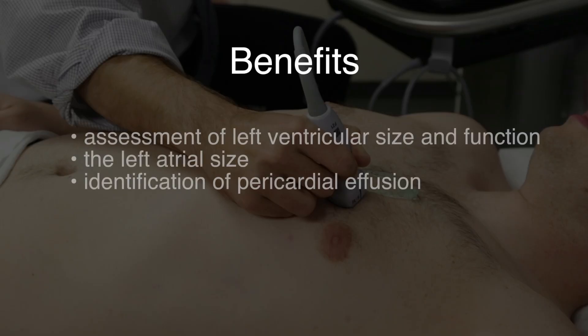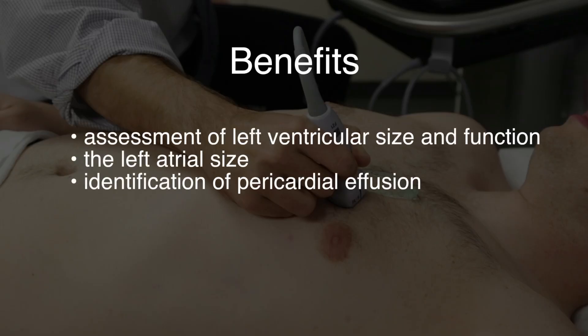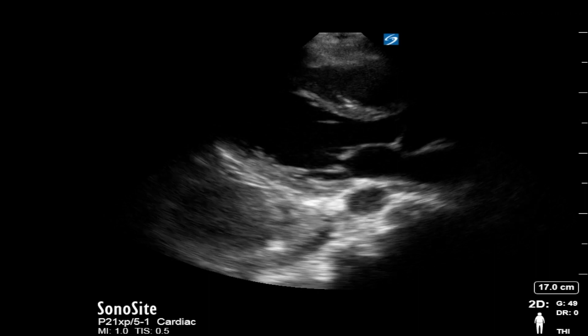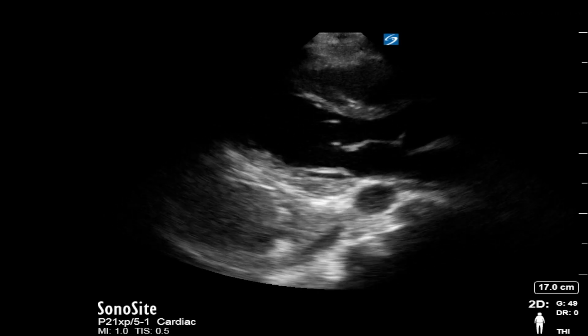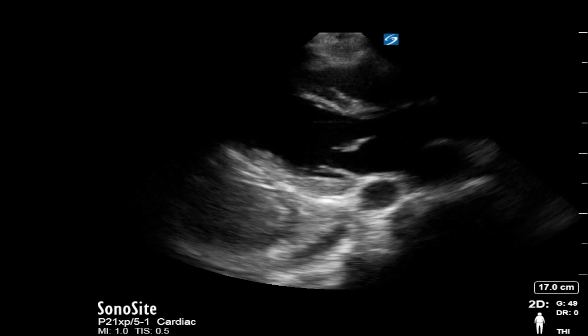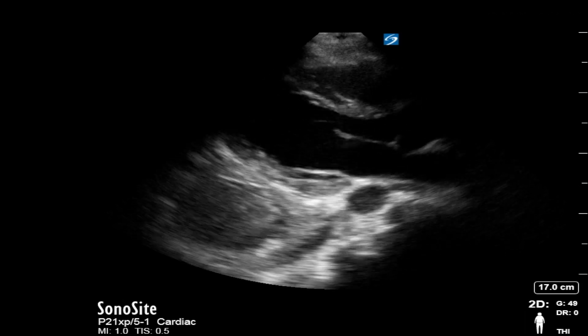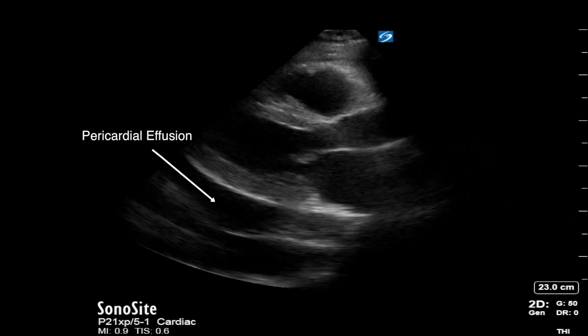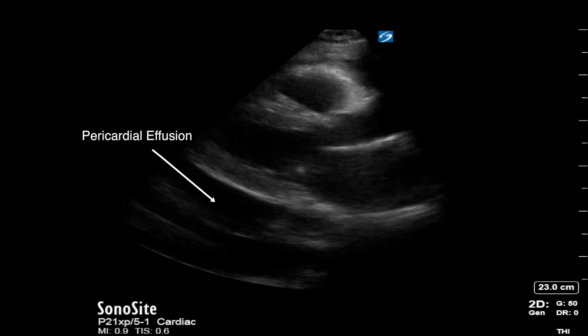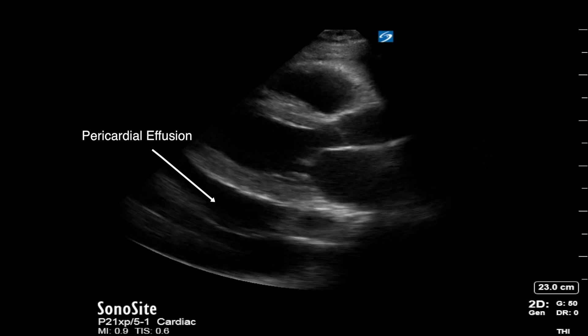Benefits of the parasternal long axis view include assessment of left ventricular size and function, the left atrial size, and identification of pericardial effusion. Here are several clips of abnormalities identified in the parasternal long axis view. In this first clip, you can see a severely dysfunctional left ventricle. In this clip, you can see pericardial effusion in the parasternal long axis view.